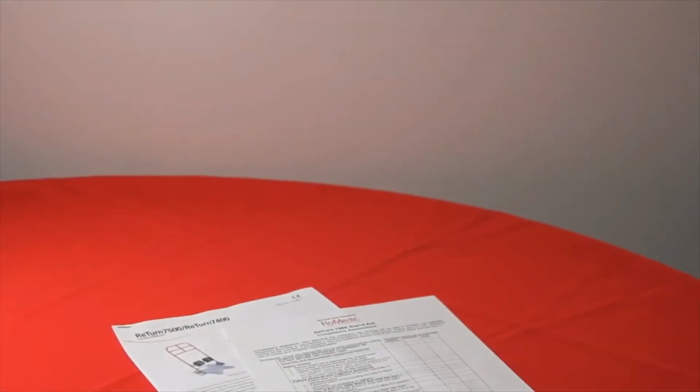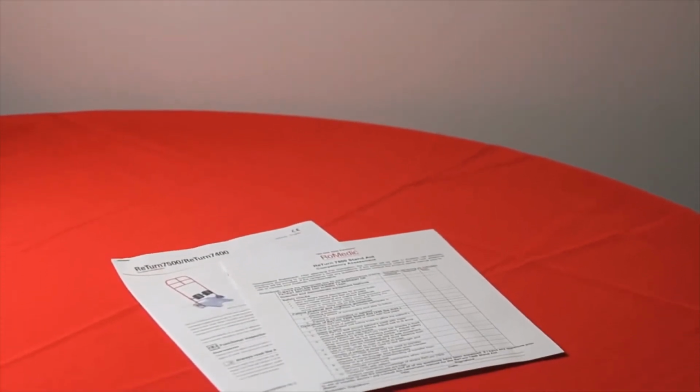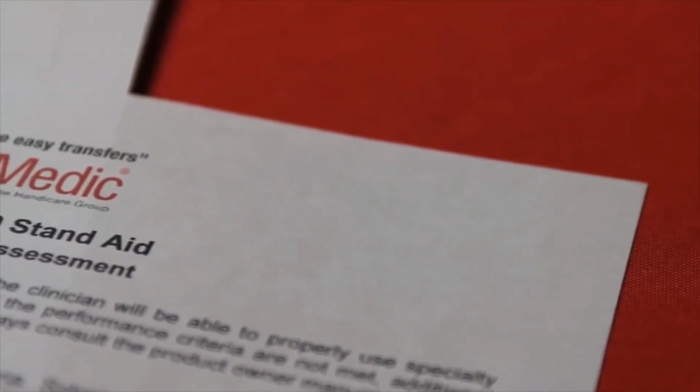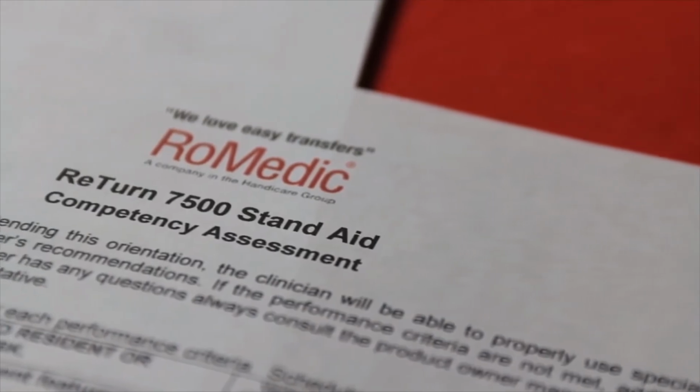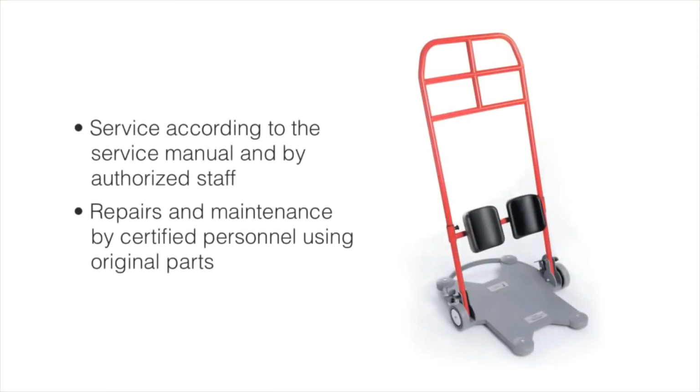The return should be thoroughly inspected and serviced when needed, and at least once per year. Pay particular attention to parts that show wear, such as joints, bolts, welds, and wheels. Service must be carried out according to the System Romedic Service Manual and by authorized staff. Repairs and maintenance may only be done by trained and certified personnel using original parts.